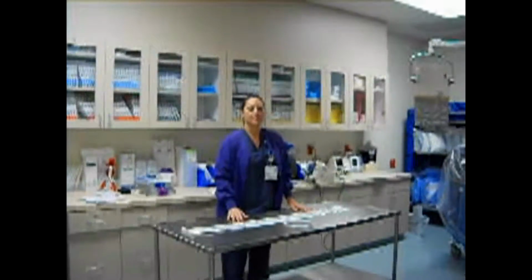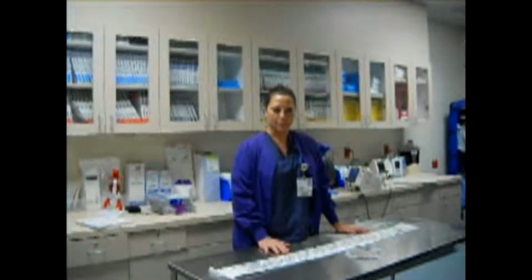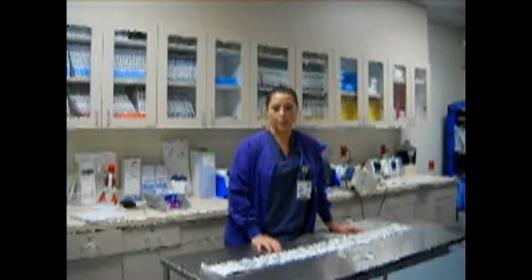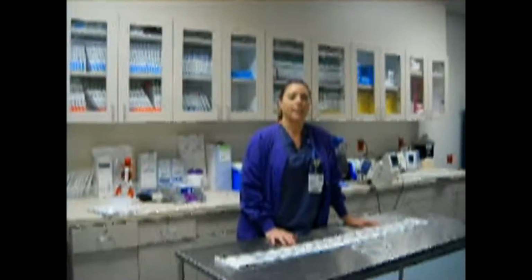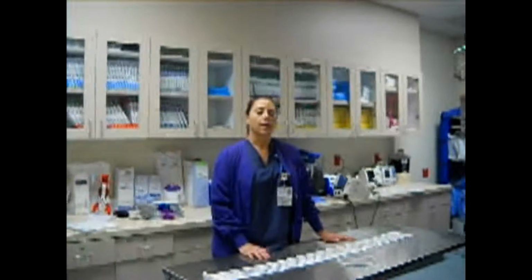Hi everyone, my name is Janine Reynolds, and today I'm going to be showing you how to do a heart catheterization. Heart catheterization is an invasive diagnostic test that's used to diagnose coronary artery disease. Another name that you may have heard for a heart catheterization is a coronary angiogram. Angiogram simply refers to injecting dye into a blood vessel under fluoroscopy.